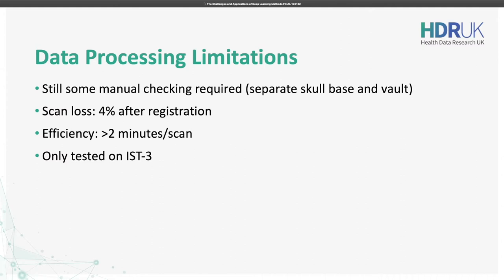There are so many different situations. This should be better handled in the future. Also during the registration, we lost about 4% of the scans. This is for deep learning to learn the distribution and the different patterns of the lesions. So it's not something wrong with the scan itself. It's just that after registration, it has a wrong registration, upside down.